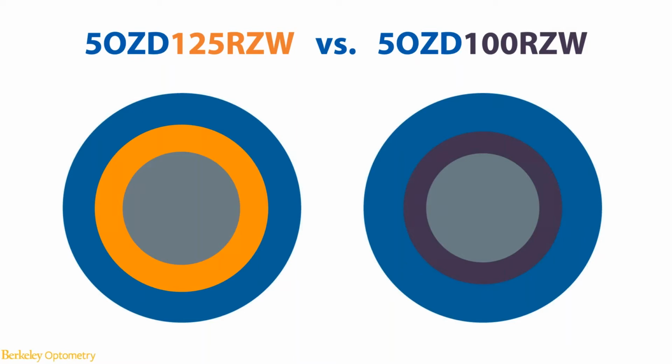Number 1, how reliable is the change on the lens design being reflected on the change of the corneal shape? After all, it's the shape of the cornea that matters in the patient's daytime vision for Ortho-K modality, not that of the lens. The second question is, what other factors other than the optic zone diameter play roles in determining the post-Ortho-K corneal shape? And number 3, if there are multiple factors at play together, what are the underlying interacting mechanisms of having these significant interactions?